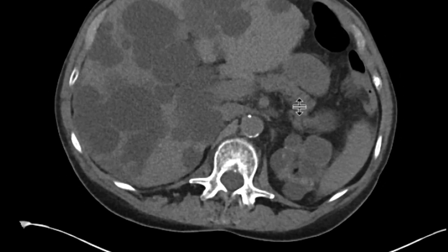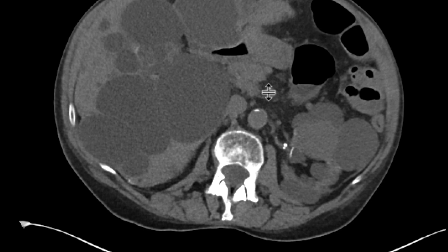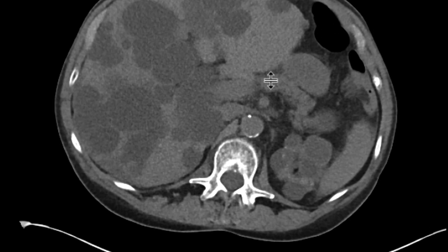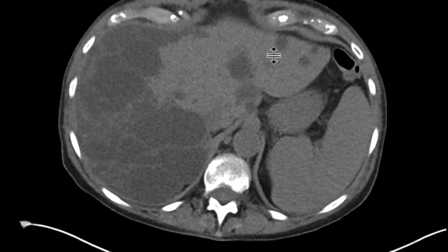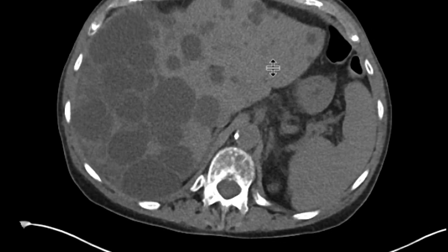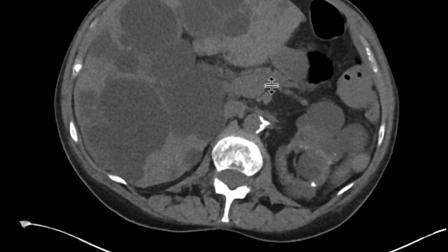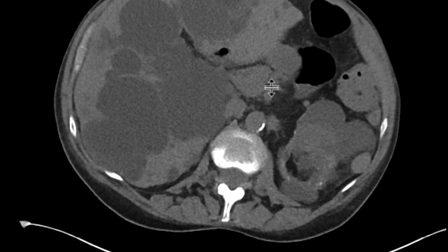Some of them have high density. Those are presumably cysts with hemorrhagic and proteinaceous debris. And so this is a patient who has polycystic kidney disease with resulting cysts in the liver and kidneys.